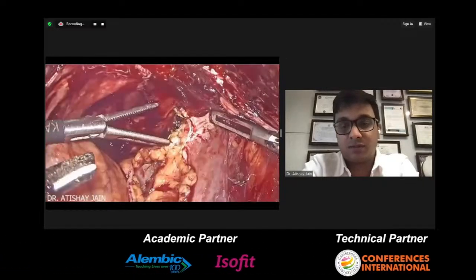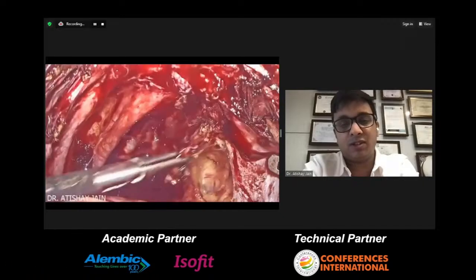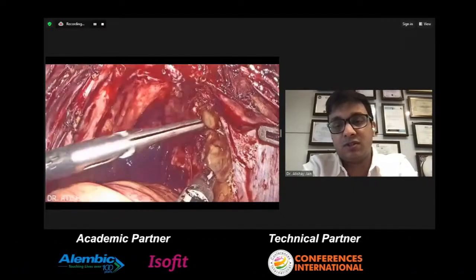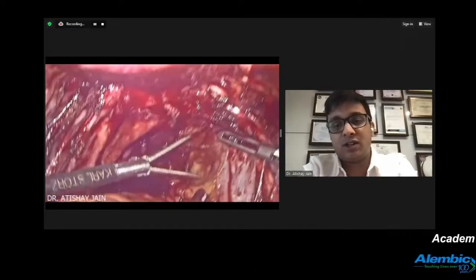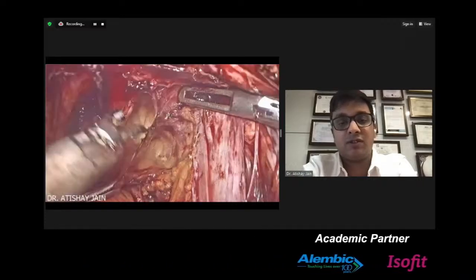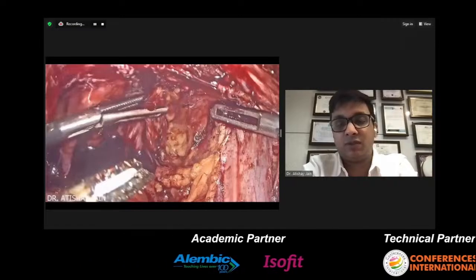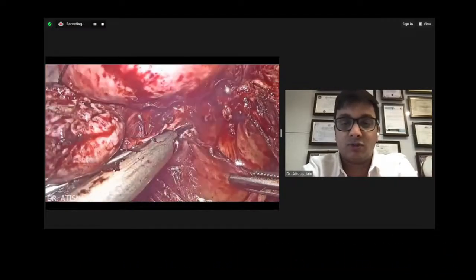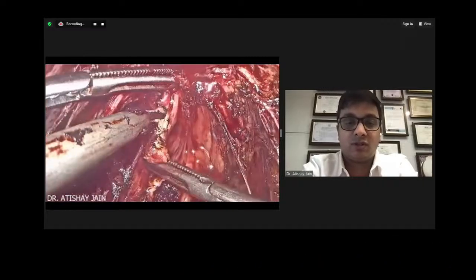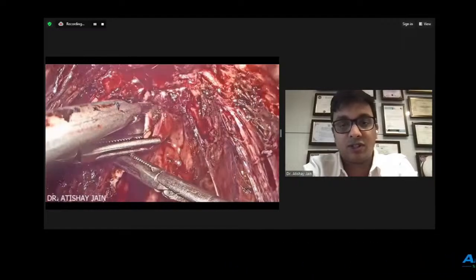And here the POD was obliterated, so we are just creating the rectovaginal space also in the same case. So as you can see very clearly, we are using the ultrasonic energy as well as the bowel grasper to create the space. We are not just cutting without seeing, but we always visualize the rectum and the rectal fat and always remain above the fat, and don't go way too deep in the fat because you might just end up reaching the rectum and cutting it down. So always take note of the fat and then cut it, rather than just cutting without seeing it.